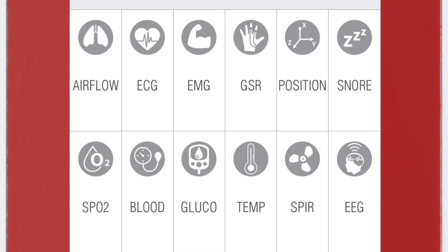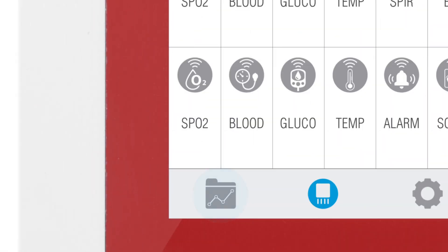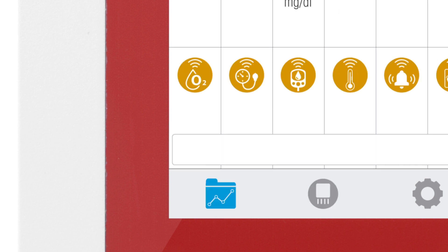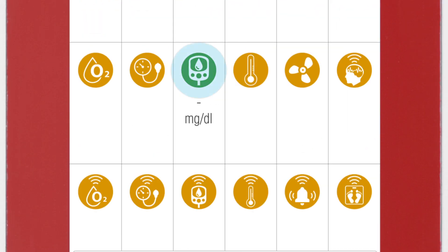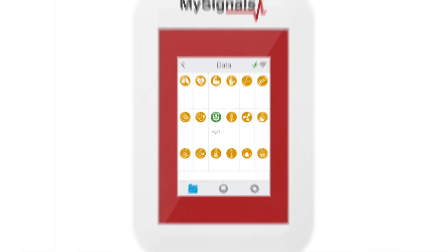You can see all the sensors available. By selecting the glucometer sensor, the icon will turn blue. Then click on the data button to access the data screen and start visualizing the data. Click on the sensor icon to start real-time data visualization.